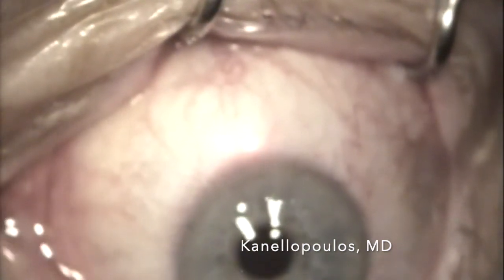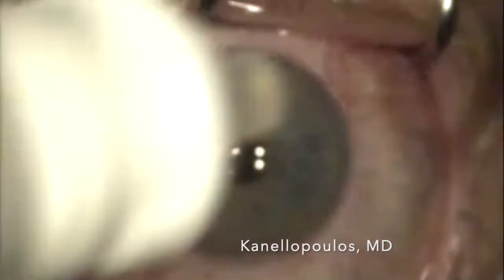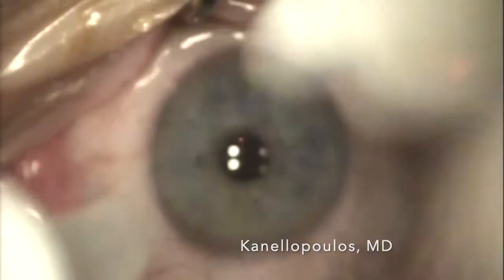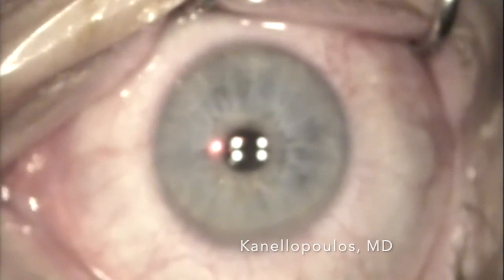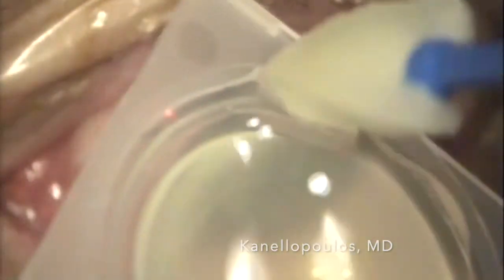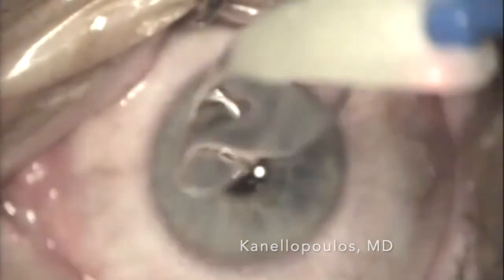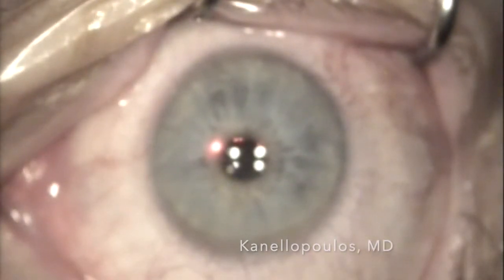We treat with 0.02% mitomycin C for 30 seconds, then chilled BSS. This is probably the only uncomfortable part of the procedure for the patient. We apply Bromfenac drops and an antibiotic-steroid combination. We're going to place our bandage lens, which has been soaked in Bromfenac solution. We use Yellox in Europe, which is a slightly higher concentration than the Prolensa used in the U.S. Here's the lens in place.